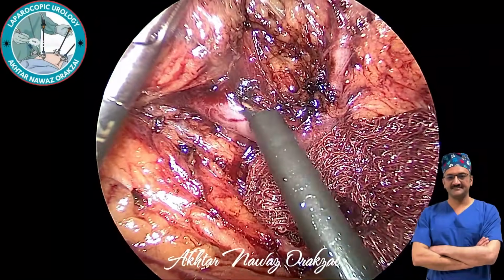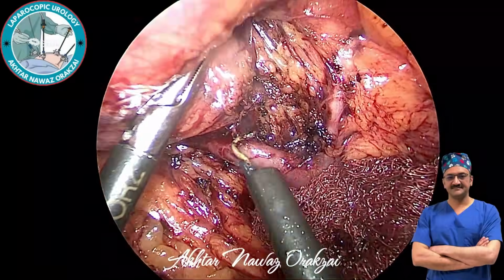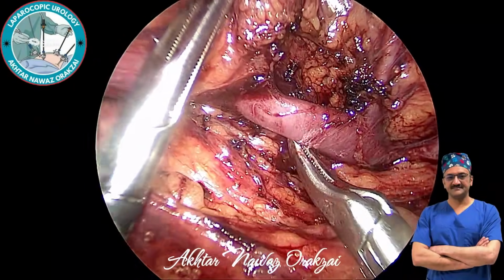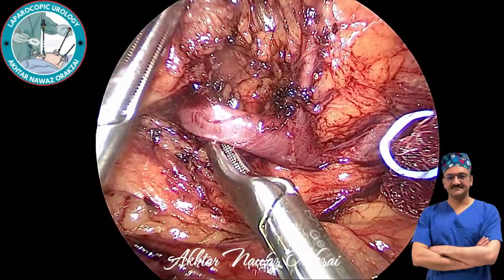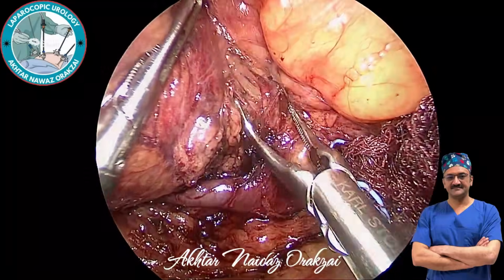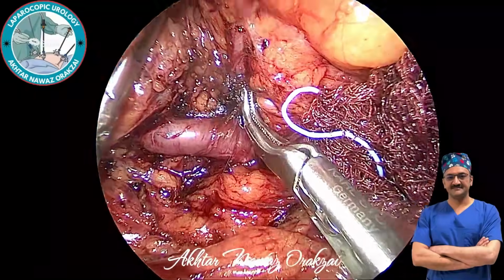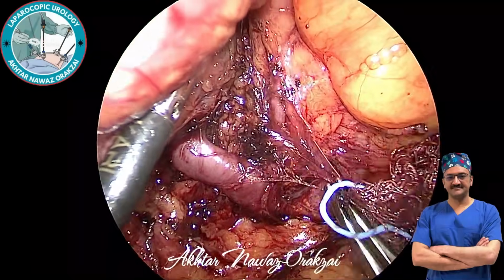Okay, the mass of the adrenal gland, it was an incidental finding. There were no related symptoms except for the hypertension, although we were suspecting clinically pheochromocytoma, but all the markers were within the normal ranges, including the cortisol, the dexamethasone suppression test, as well as the urinary VMAs, and also the metanephrines, plasma metanephrines.